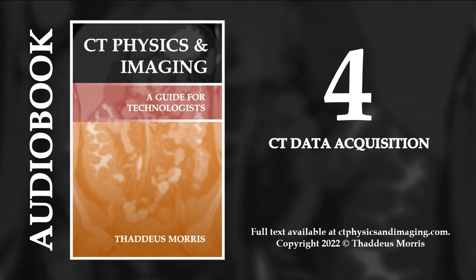The large, which is 50 centimeters, and the small, which is 25 centimeters. Any area within the scan field of view can be recovered through retrospective reconstruction, even if it's not initially included in the display field of view. Once the original scan data is removed from the computer, this would be impossible.